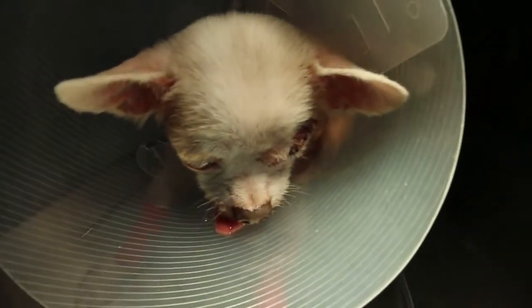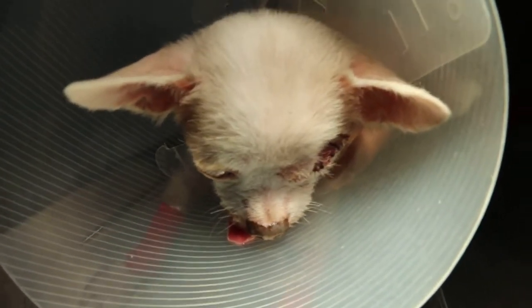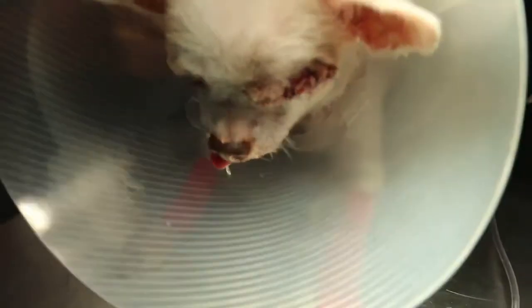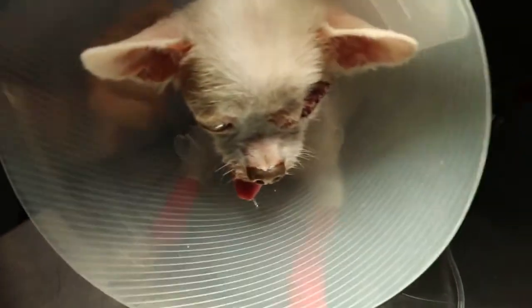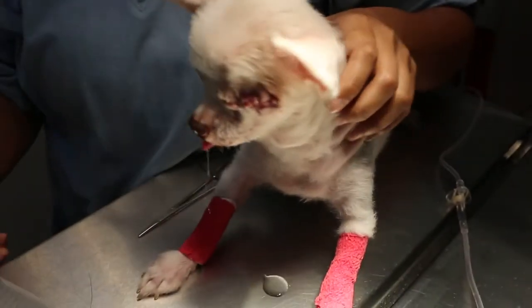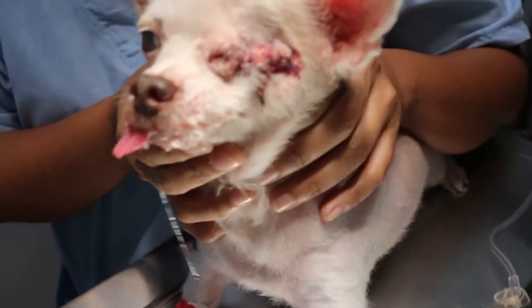Now, there was not much bleeding because I ligate the optic nerve plus blood vessels. Without ligation, there will be a lot of bleeding. And take out this collar first. You can see that it's very important to ligate the optic nerve and blood vessels. Turn out a bit. You can see there's practically no bleeding.